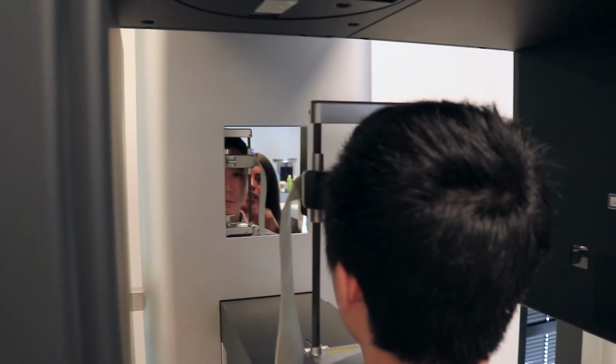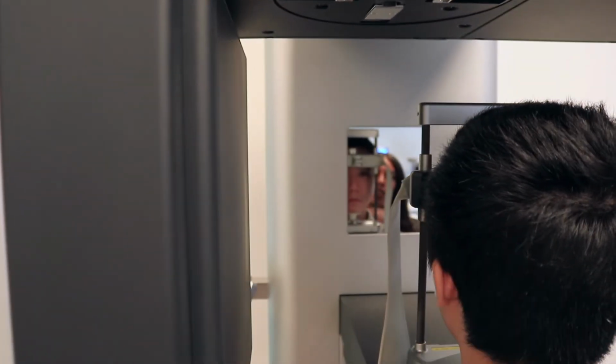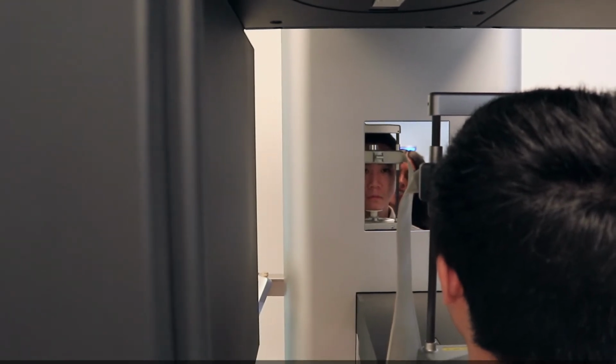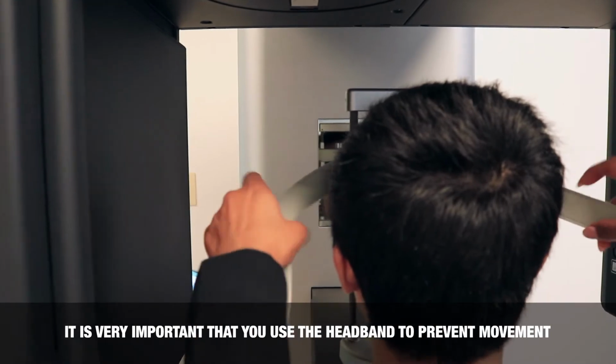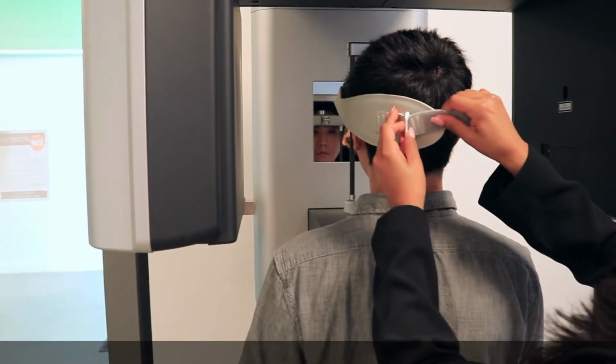Looking from behind the patient, use a mirror to make sure that the patient is straight and not tilted. Use the headband to help secure the patient's head into place.